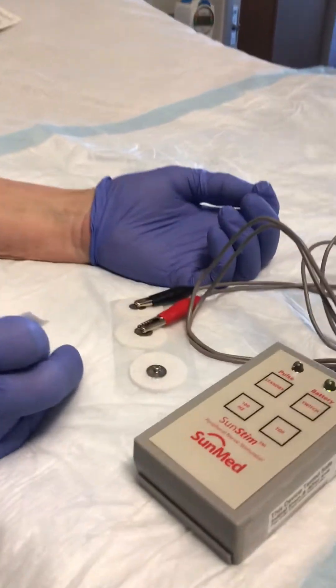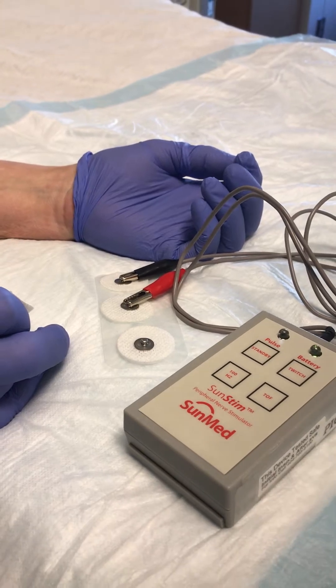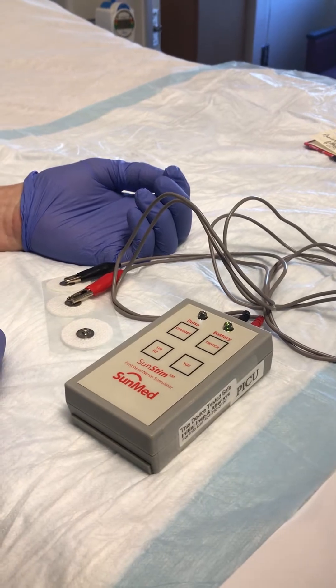The type of electrodes we use are the ones found on the defibrillator. You would find these in the pod 2 omni-cell, and the nerve stimulator is found in the drawers at the med stations.